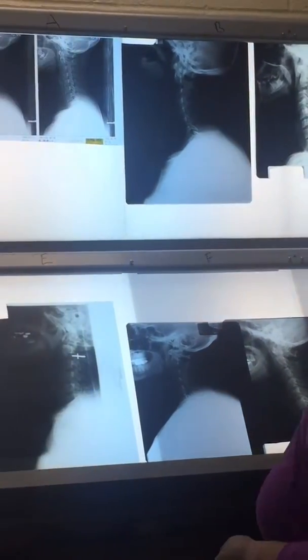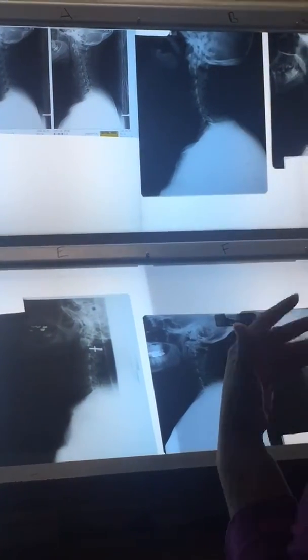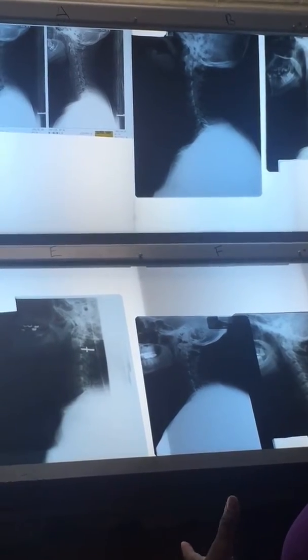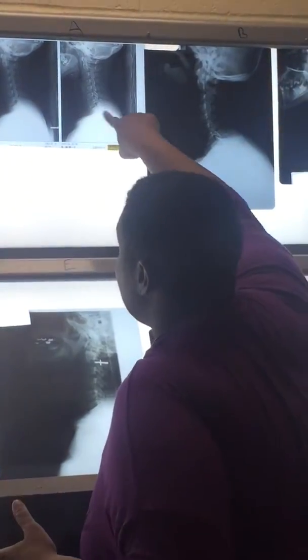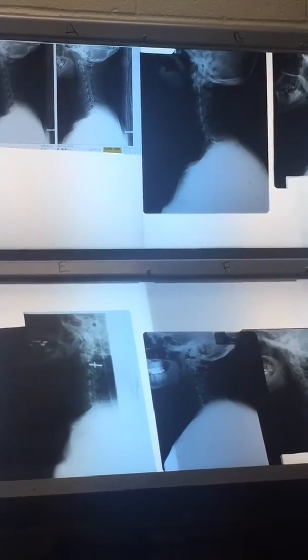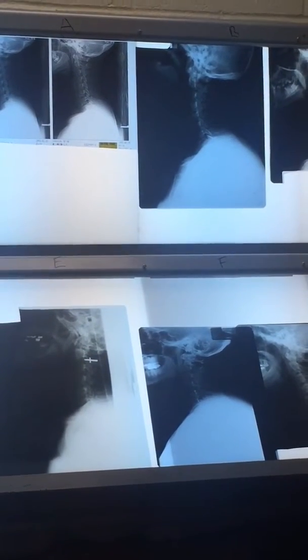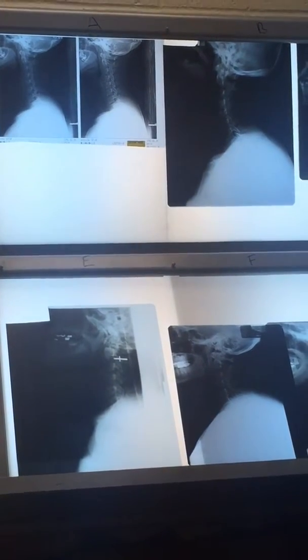Alright, so in terms of knowing your evaluation criteria and what projection it is, I'm also going to ask you how many vertebrae you see. If I just use the word vertebrae, then you have to include T1. If I ask how many cervical vertebrae, then you just say 1 through 7 or however many are visible, which you do have to count. One image of the lateral will have all 7 and be textbook.